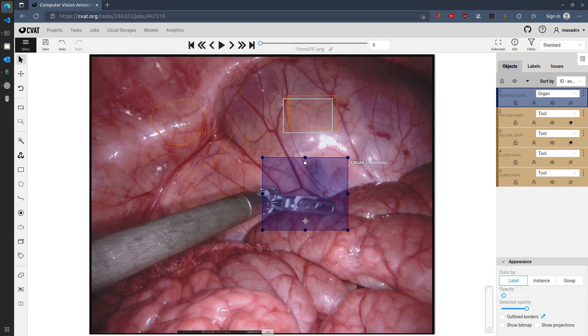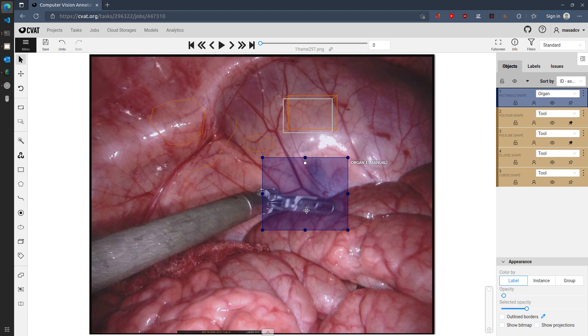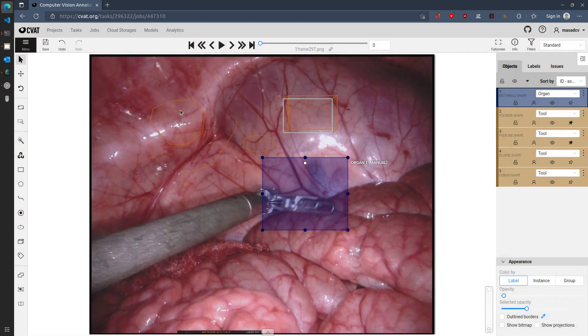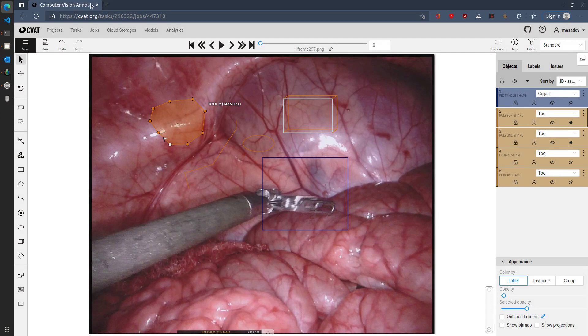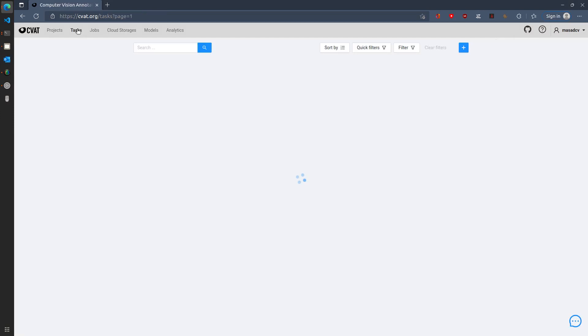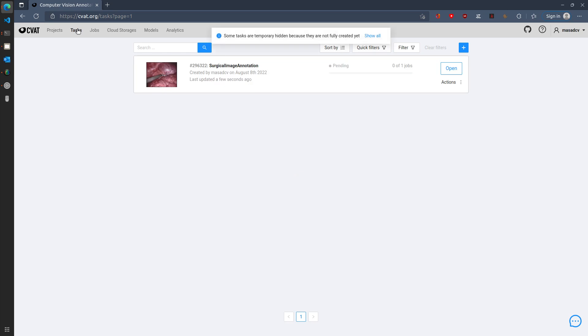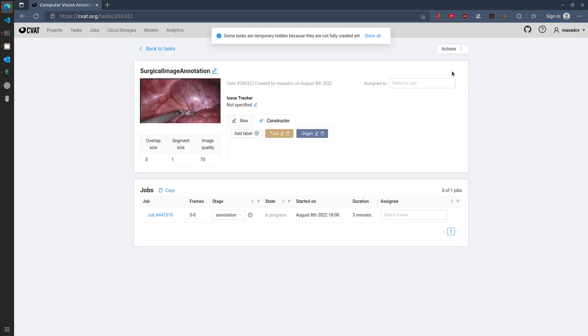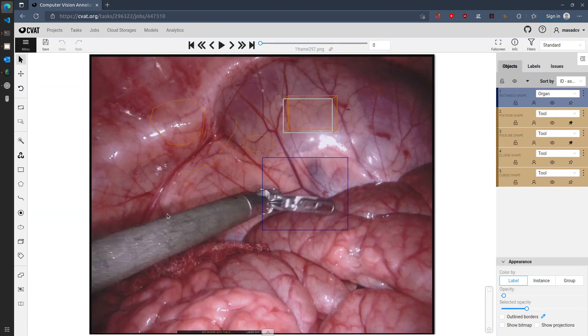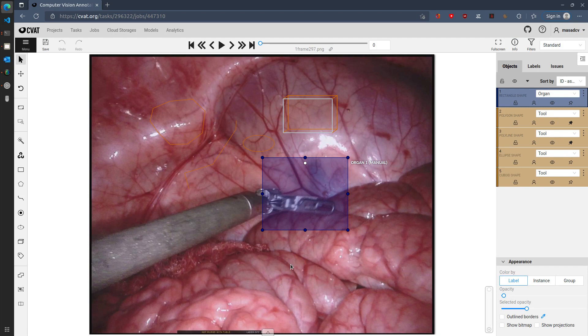So let's say you're done with your annotation and you may want to come back to this later. So how you can save this is by clicking on save and by simply closing the window to close the session. You can access the task again by clicking on open on the task and clicking on your job that you are looking into, and then you'll be able to start from where you left.